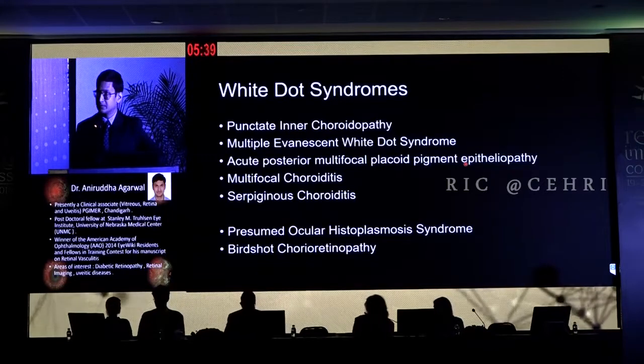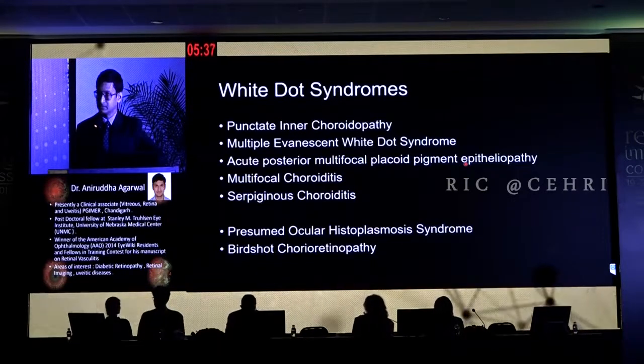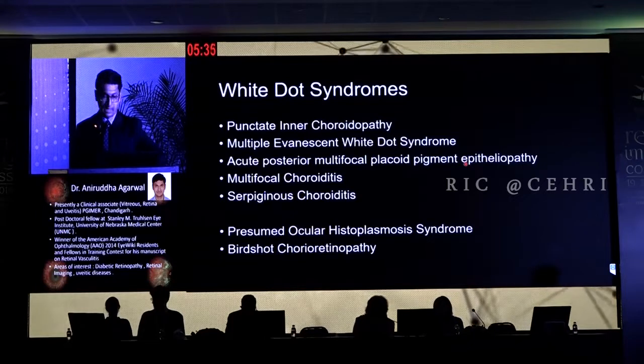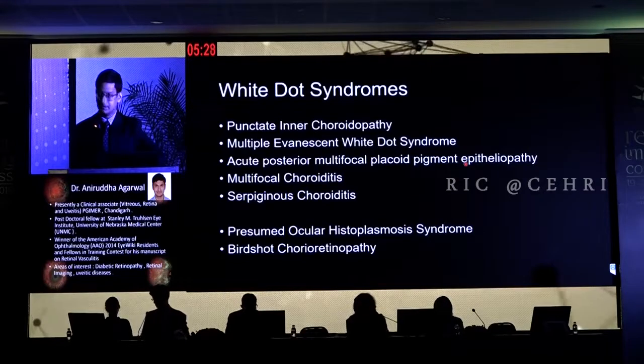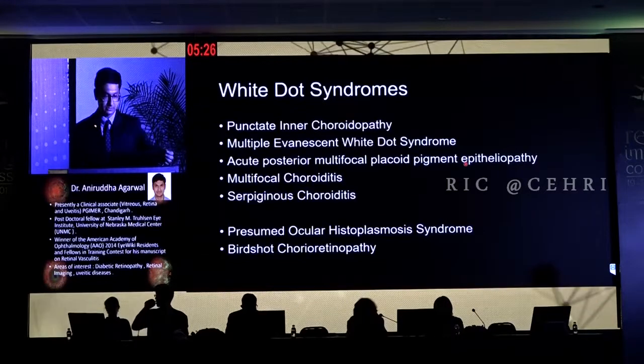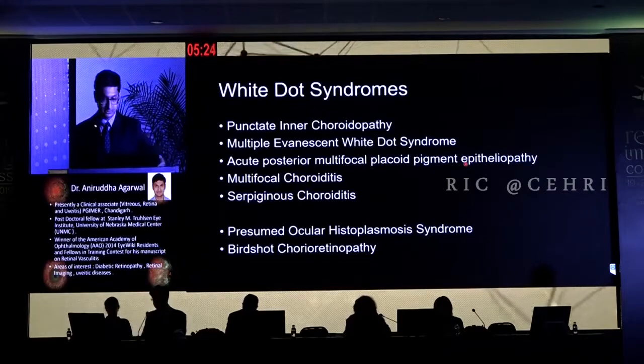So what I would be covering in my talk would be punctate inner choroidopathy, MEWDS, AMPPE, multifocal choroiditis, and serpiginous choroiditis. And there are two more to fill in, that is the POHS and birdshot. And since we don't see them much in our subcontinent, I'm just going to avoid speaking on those.